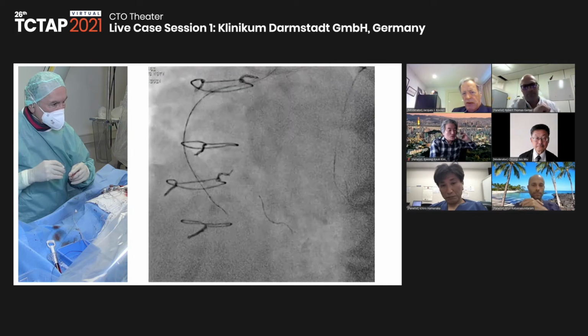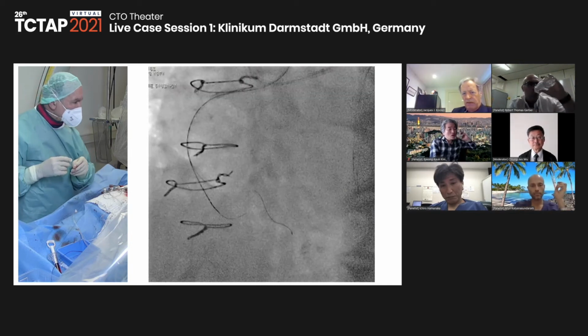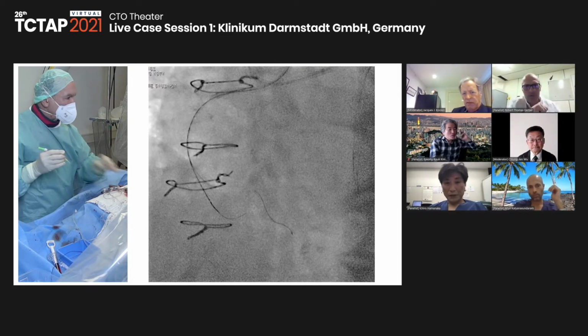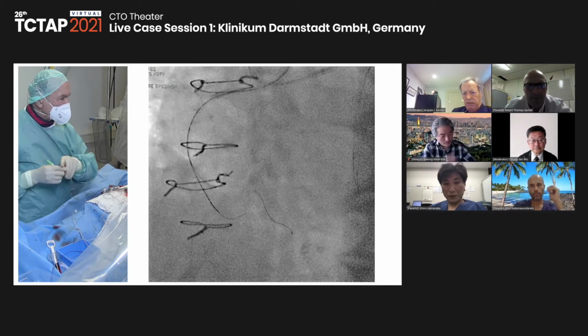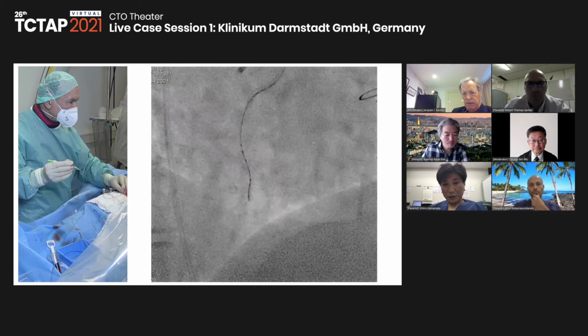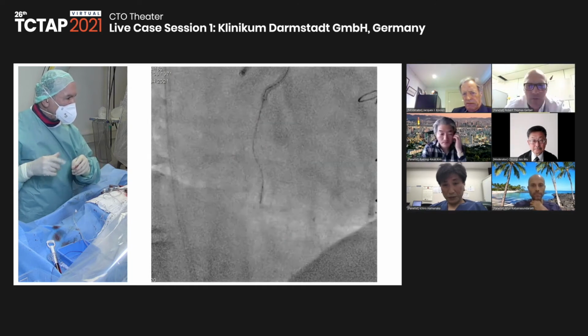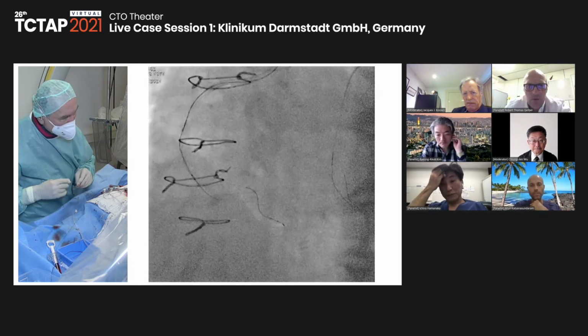Yeah. Most of the time, once you've been there, it'll get down easy. It looks a little bit different. Yeah. Definitely, I'm in another RV branch. Yeah. There's another curve there. More like this. Oh, yeah. Maybe now I'm better. Looks a bit better. Yeah, I'm more in the center of the calcium now. Looks like it, yeah.